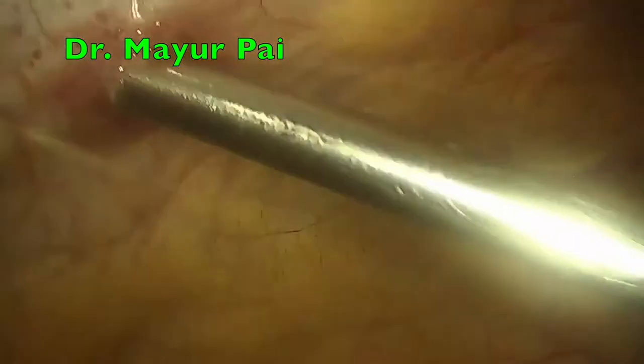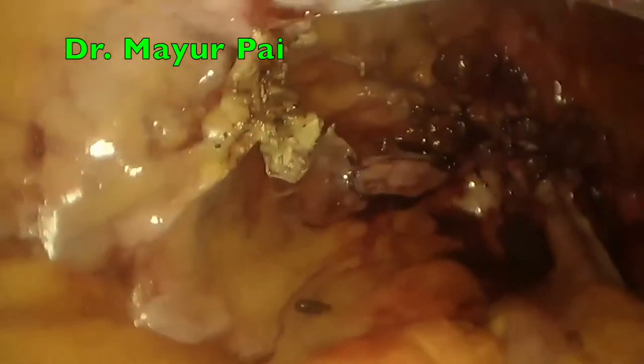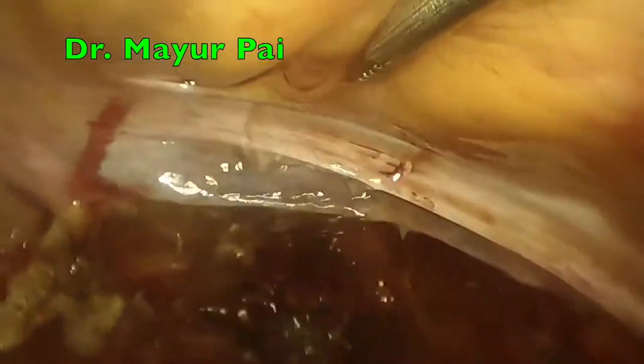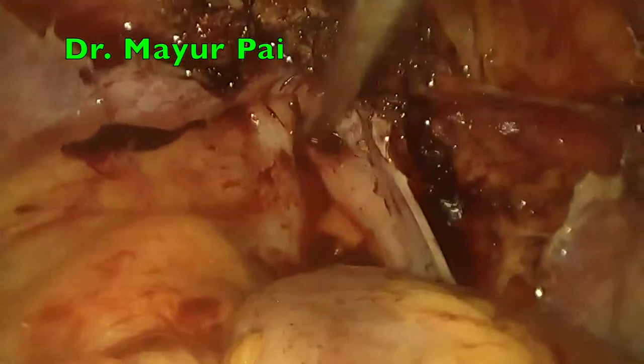At the end of the case, we give a wash with warm saline and we look for any bleeding or oozing that may be occurring. It is always important that the needle is removed out under vision, which prevents any complications.